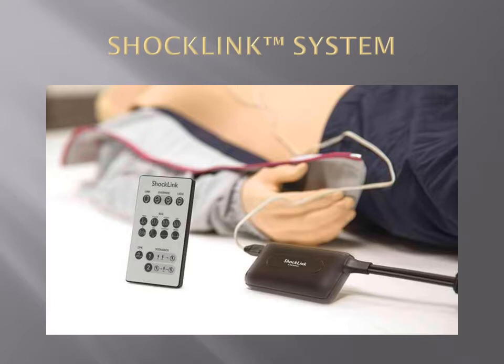This solution means that you can train on most mannequins, removing the need to specialize defibrillator training mannequins with chest studs or a load box to absorb the shock.